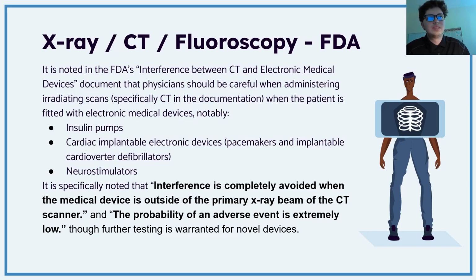FDA's interference between CT and electronic medical devices is a key component for when you're imaging a medical device. Whether or not the CT environment is going to cause any damage or malfunction on the device, and thus patient harm or risk. So what was specifically noted is the insulin pumps, cardiac implantable devices, neurostimulators, but it is also mentioned that the interference is completely avoided when the medical device is outside of the primary X-ray beam of the CT scanner, and that the probability of an adverse event is extremely low.